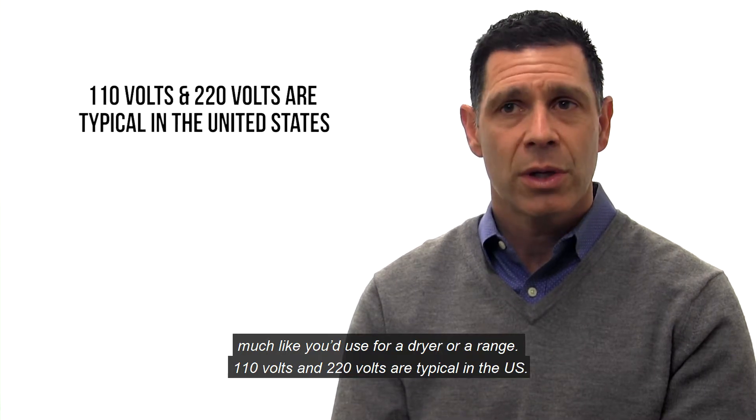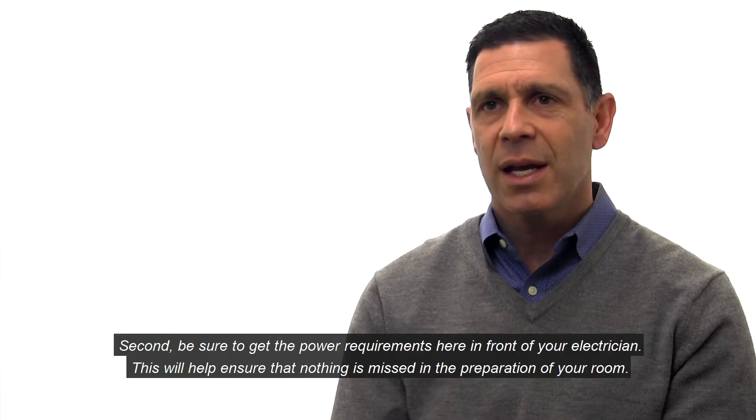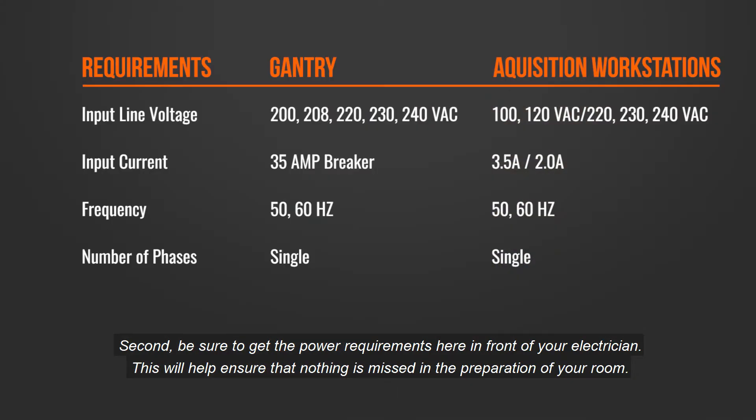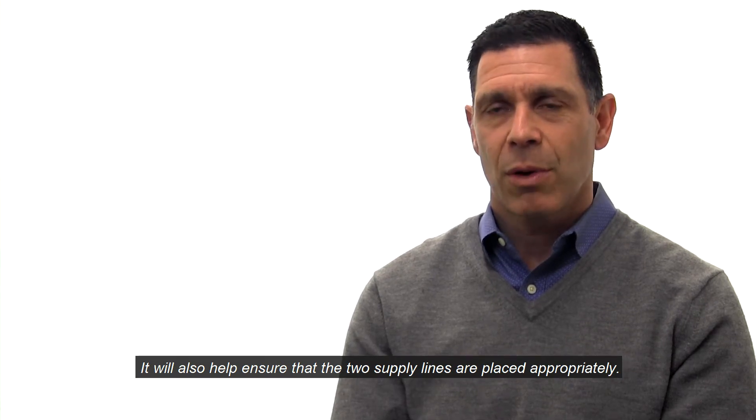110 volt and 220 volts are typical in the US. Secondly, be sure to get the power requirements in front of your electrician. This will help ensure that nothing is missed in the preparation of your room, and will also ensure that the two supply lines are placed appropriately.